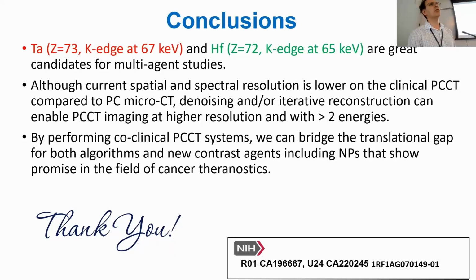Well, it depends on how many contrast agents you are going to use. For 2 contrast agents, that 65 was perfect for tantalum and hafnium. If we would have more, in our case, preclinically, we had 20, 34, 50. So 50 was just before that 65, and they were great for separation of those elements in particular, and also for the others.